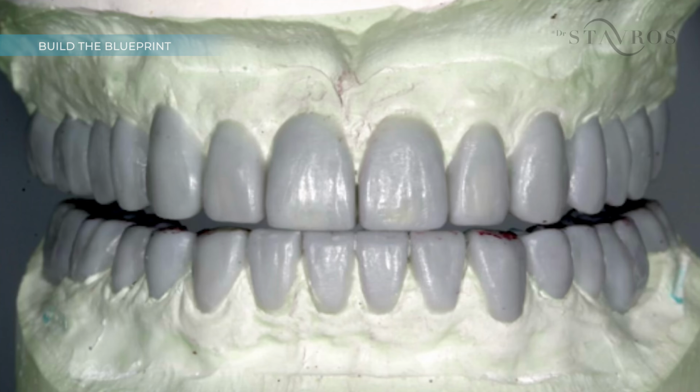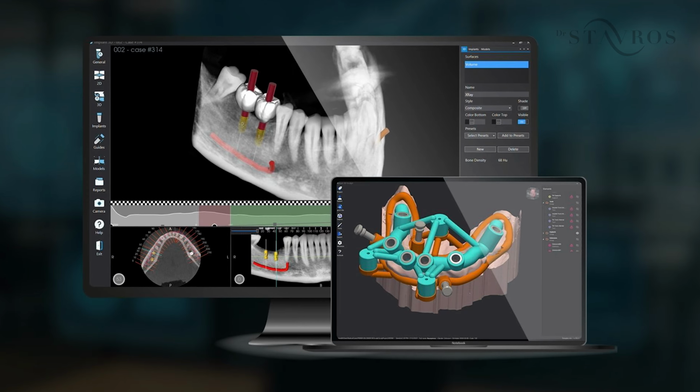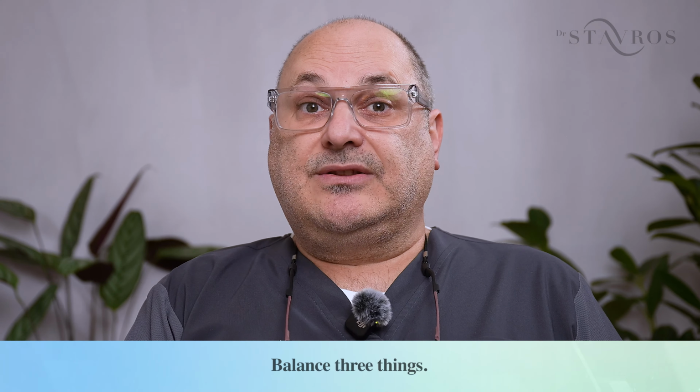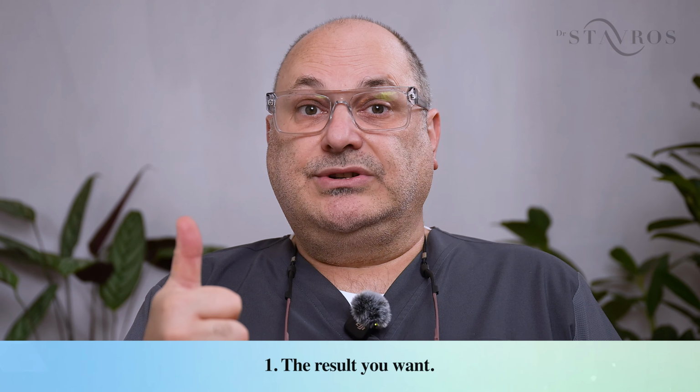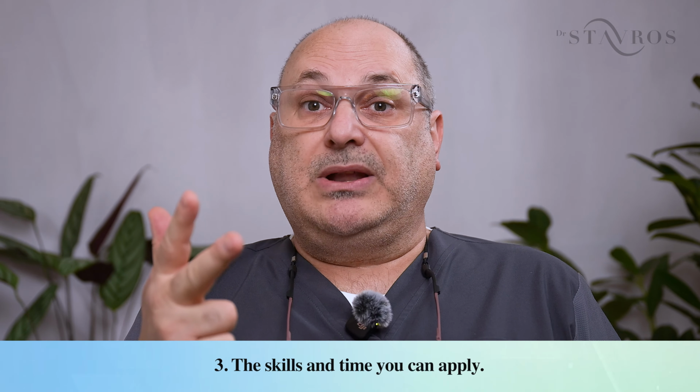So let's build the blueprint. Start by creating a diagnostic wax-up or a digital tooth setup. Align your STL files with your CBCT scan, trace the screw axis trajectory, define the emergence profile, and this will show you where the bone and soft tissue must exist. If anatomy is missing, this will tell you that you need to build the tissues and when to build it. Reverse engineer the plan. This is not yes or no, it's a spectrum. Balance three things: the results you and your patient want, the biology you have, the skills you have, and the time you have in your hands to apply all this.